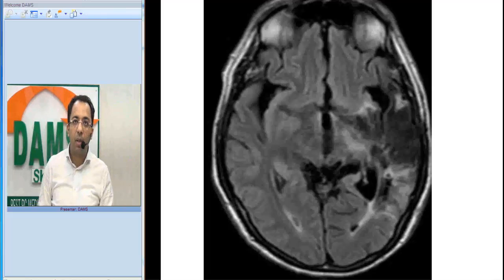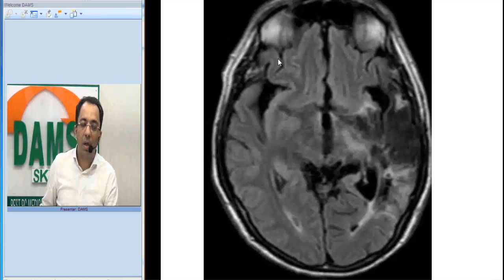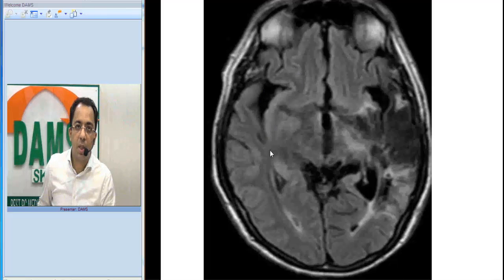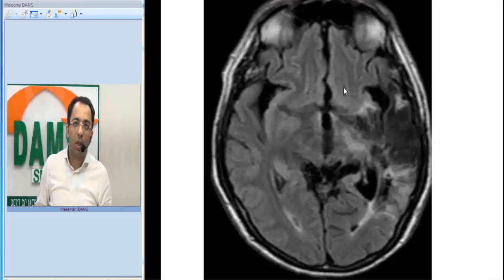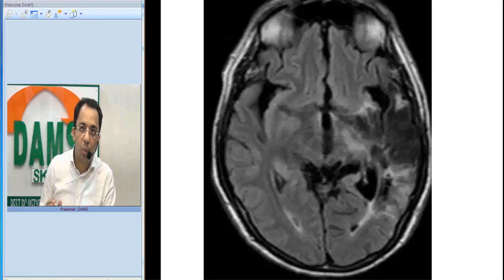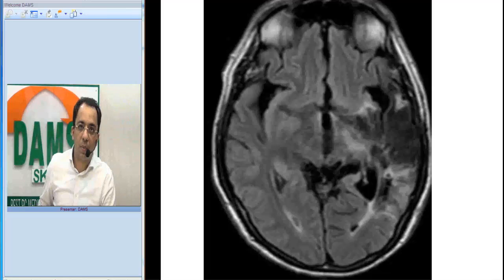This is an MRI image of the brain. Which sequence do you think this is? This is a MRI brain FLAIR sequence. How do we know this is a FLAIR sequence? CSF is dark and the white matter also appears dark, meaning the brain has properties of a T2-weighted image while the CSF signal has been suppressed. This is a FLAIR sequence.